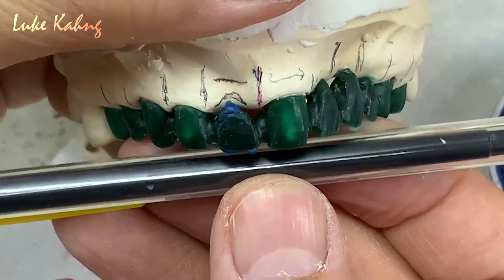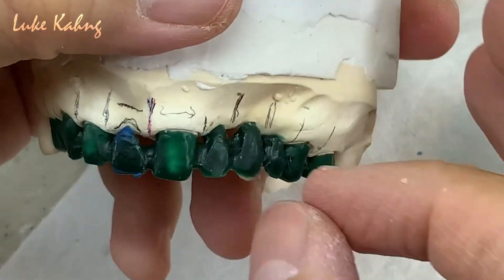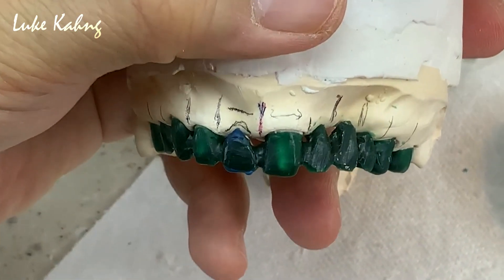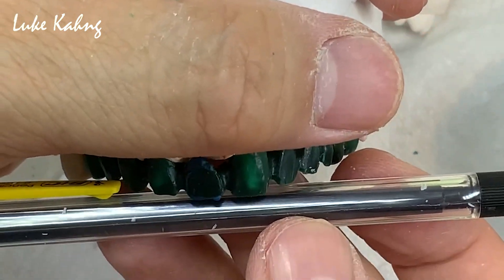Horizontal is good — just make sure it stays horizontal. Canine to canine has to be right. Here is longer, here is shorter — to me this is too long, so I cut it just a little bit. Then I can match it with adjacent teeth.